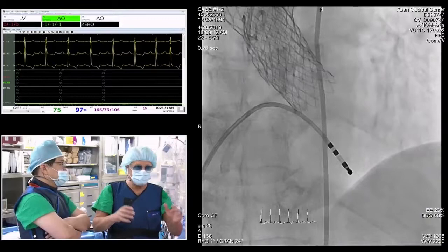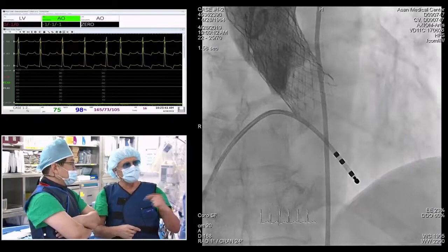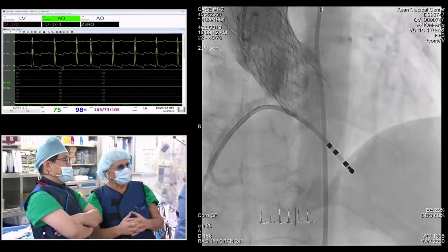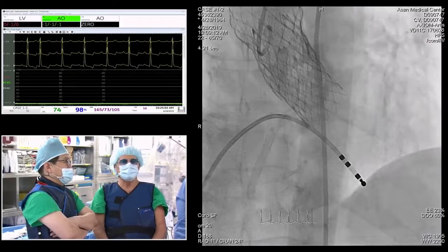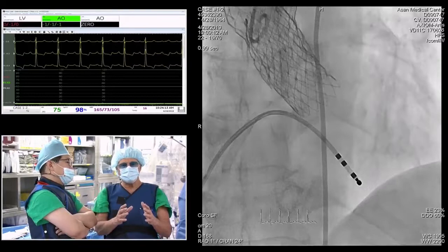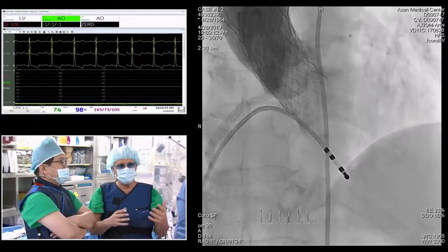The second thing is whether we really did need the PRO. That's questionable, and looking at how easy and smooth the R went through, in retrospect I would have said maybe we could have taken the Evolut R, avoiding both the slip and the problem at the bifurcation. So yes, we would have done things differently if we had known what happened during the PRO case. It's always good to reflect that even in a difficult access situation, even one or two French difference makes a difference at the access. I confirmed him and supported him in using the PRO, even though it might not have been necessary.